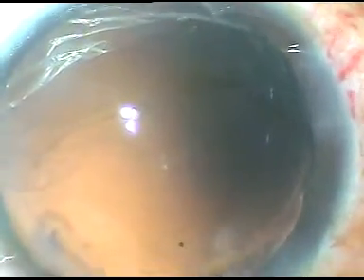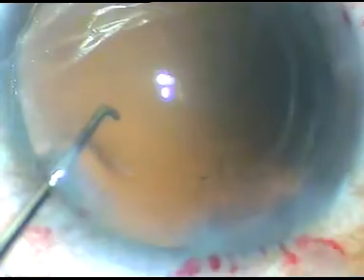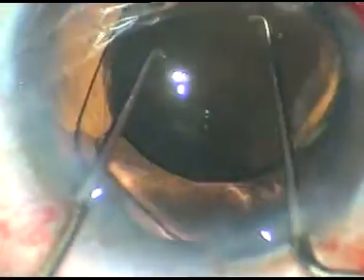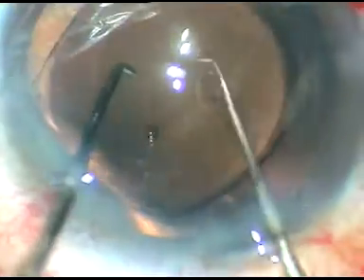Now in this case I am going to implant a hydrophobic acrylic intraocular lens. This is the intraocular lens. The leading haptic as well as the trailing haptic goes into the capsular bag. Now the Sinskey hook and the chopper are used to dial the intraocular lens and place the haptics in the bag.